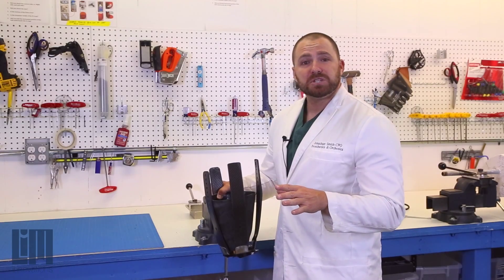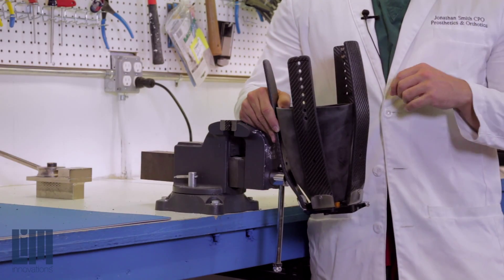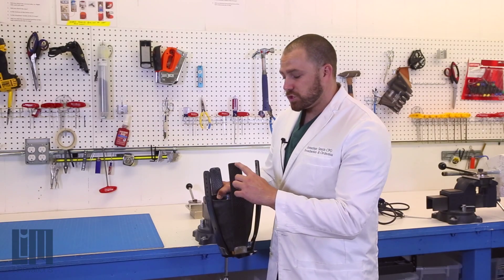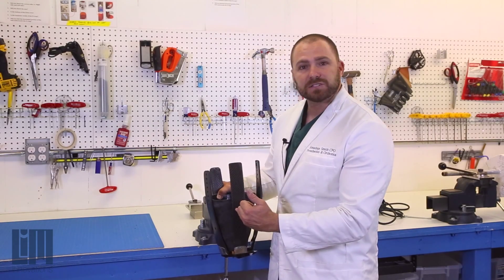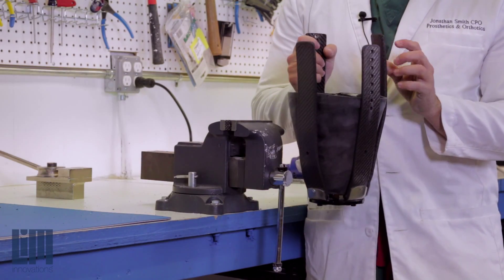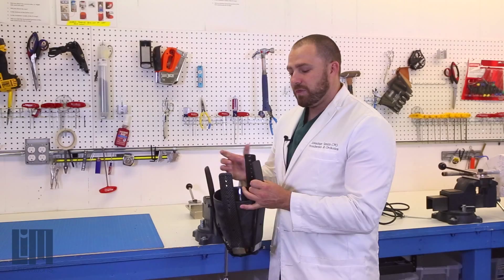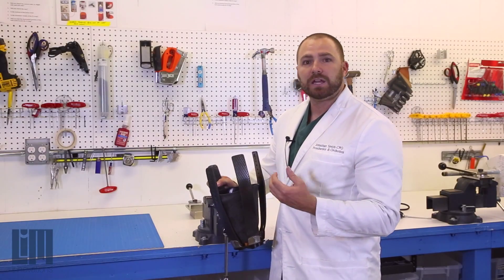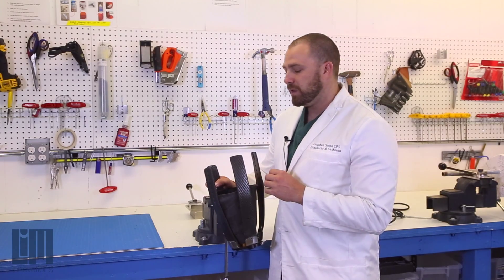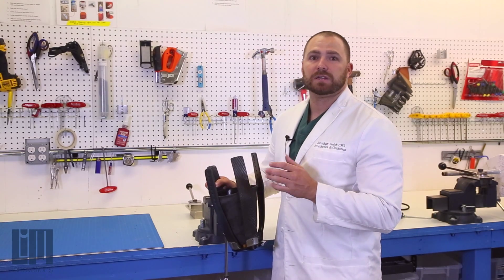Now that we've left the machine room and buffed and beveled our struts, we want to pay attention to two things. First, make sure all four struts are cut straight across — perpendicular to the long axis; we don't want any sort of an angle. Second, make sure you don't have any sharp corners or edges on each strut top. If you have a sharp corner or edge, it'll dig into and wear down the internal surface of the brim, shortening its life. To extend the life of your brim, make sure it's nice and round and smooth.